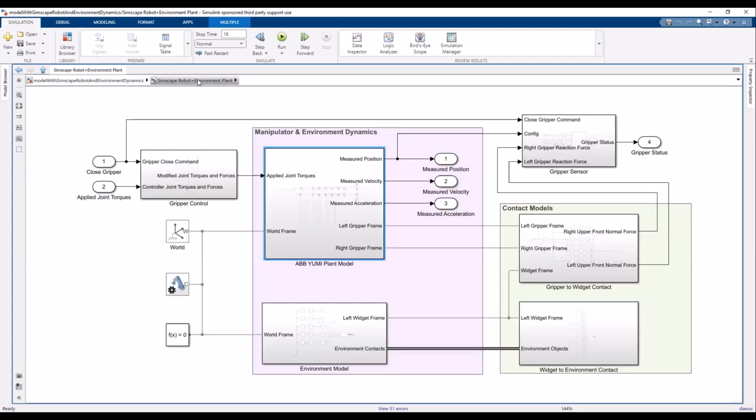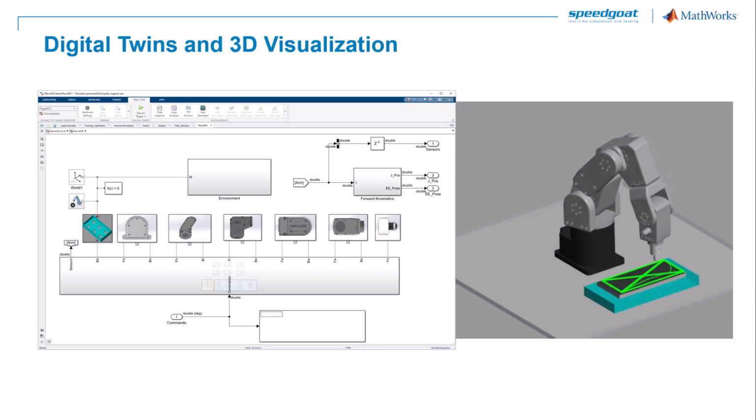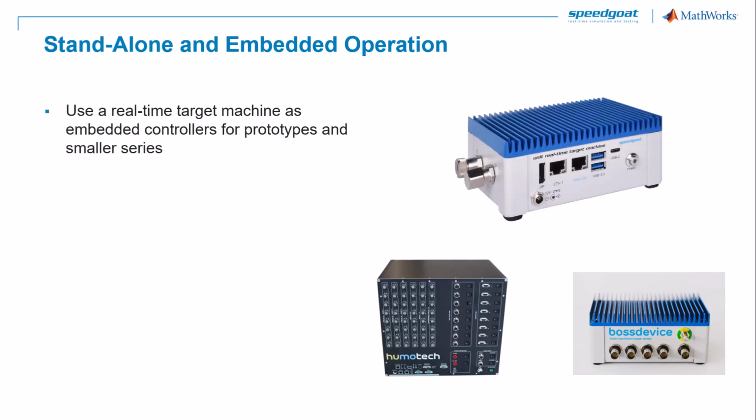Then we have models for gripper control, joint torque control, and trajectory planning, which we can explore, customize, and adapt to our needs. Using the imported CAD model allows us to implement this digital twin of the robot arm against which we can test and validate our controller. Following rapid control prototyping and hardware-in-the-loop testing, it is also possible to use Speedgoat target machines as an embedded controller.